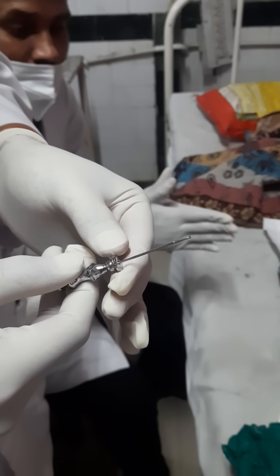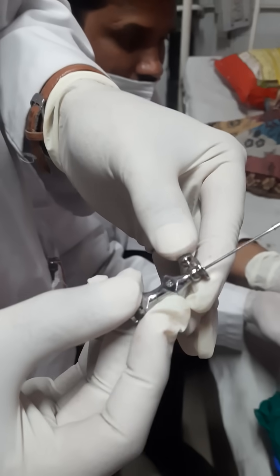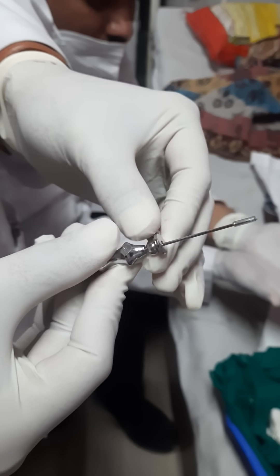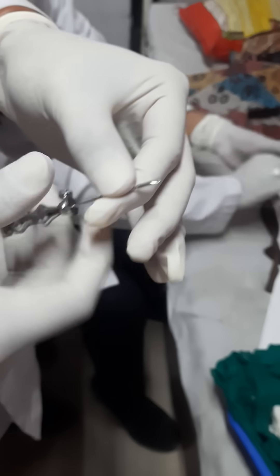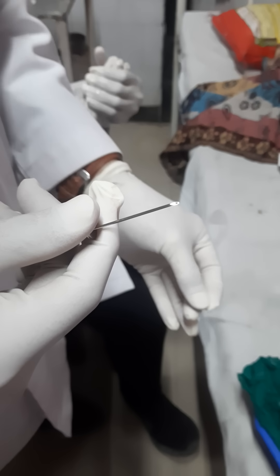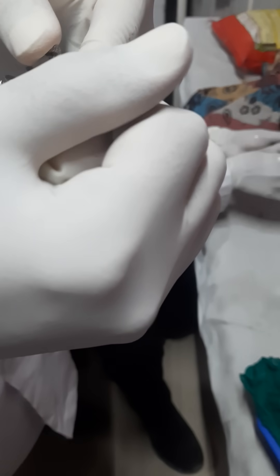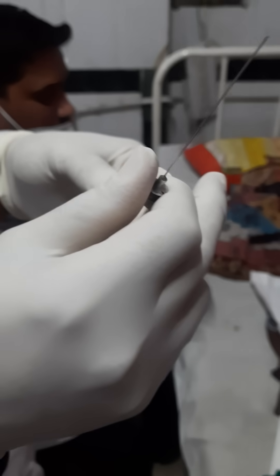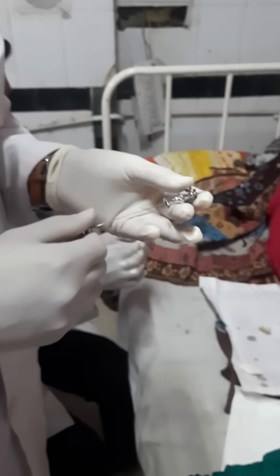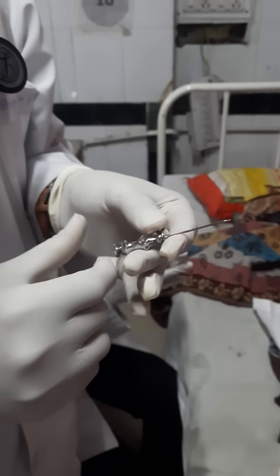You can see the bone marrow needle — number 18. This is the guard which you can adjust; usually we keep it at the posterior-most position. This is a simple rubber guard to protect the point and end of the needle. We will remove this, then check whether the alignment with the bevel is proper or not. This is the bevel of the stilette; this is the bevel of the needle itself — you have to check the alignment. If the alignment is good, the needle will pierce well.